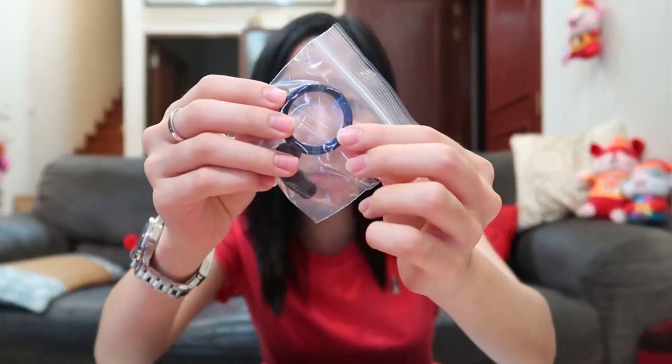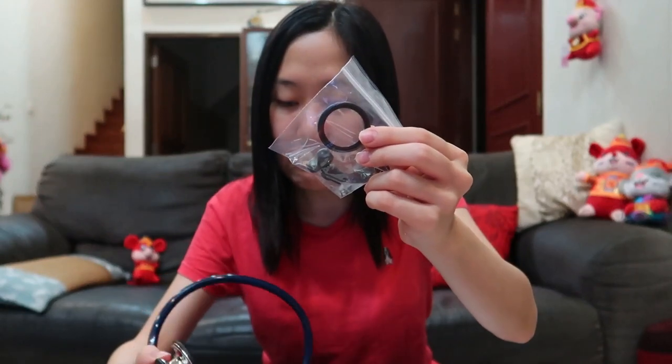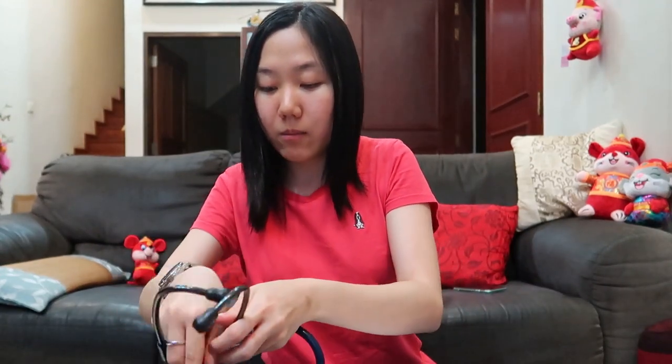Oh my god, it sounds so cool! Oh my gosh, I'm so excited for medical school now! Also in the box it comes with an extra earpiece and a ring, though I'm not sure what the ring is for — maybe my teacher will teach us. Let me keep them.